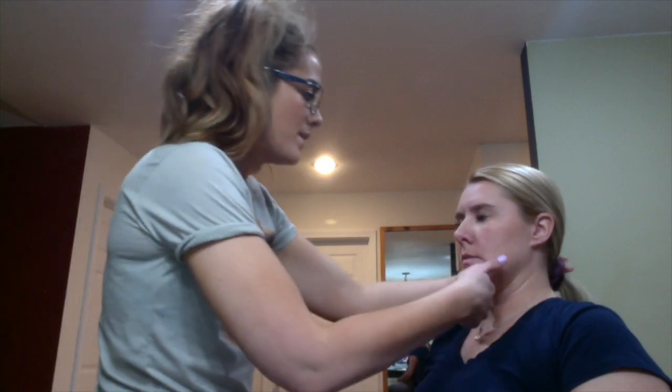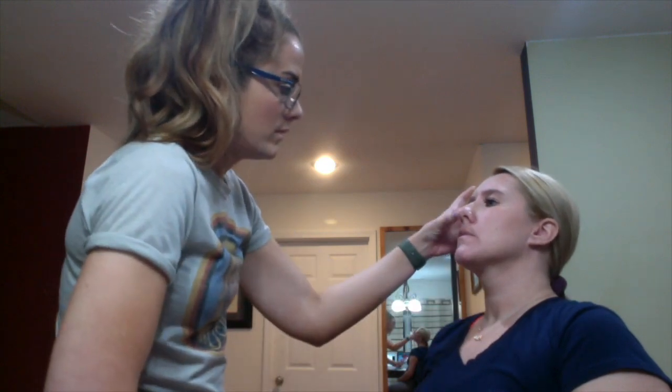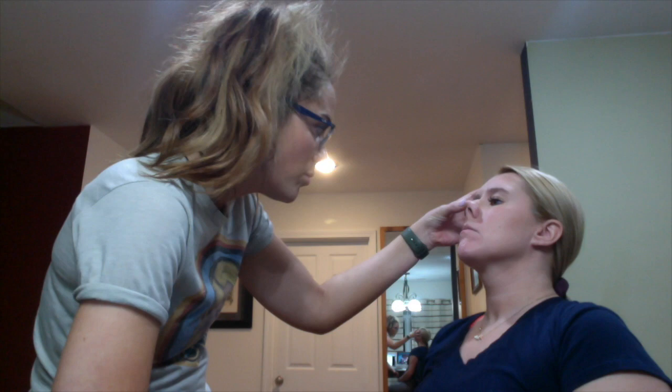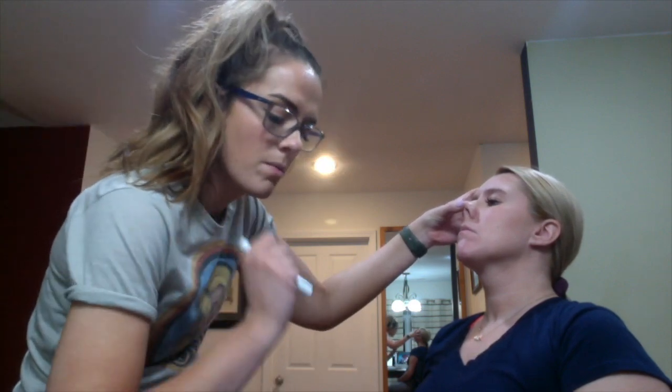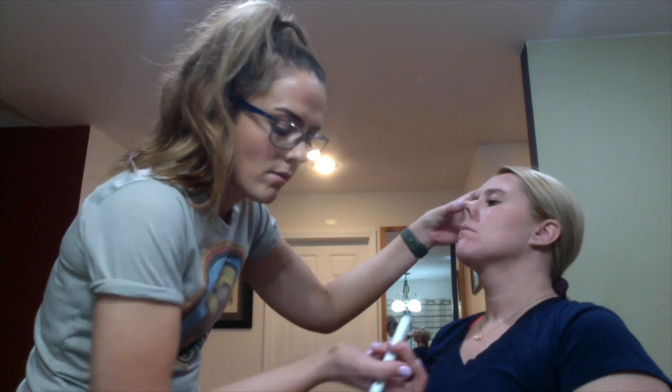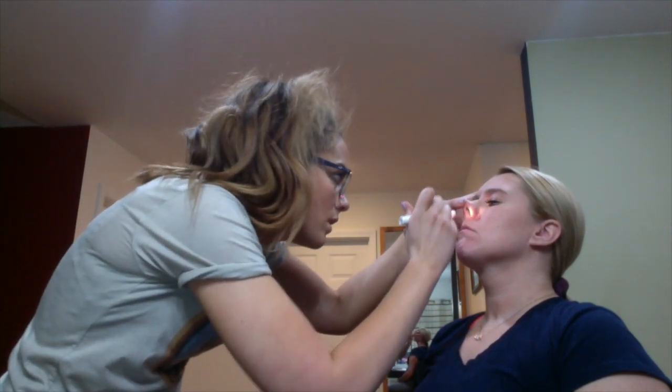For the nose exam, you first inspect. You're looking for symmetry, looking for any obvious physical abnormalities there. Then you'll have the patient flex their neck back. And with your non-dominant hand, you'll pull back on the tip of the nose. And with your otoscope, you'll shine a light to look at the mucosa.